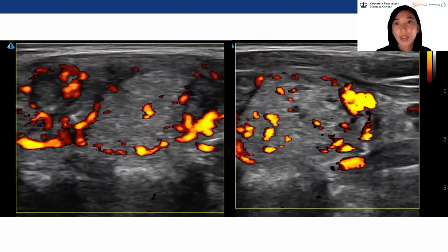And this is what her vascular supply looked like at 3 months. So you can see superiorly, the flow from that teeny tiny superior pole vessel came through and was feeding what I had previously ablated in the superior medial aspect of the nodule. And then inferiorly, although I couldn't capture it well, this vessel here was actually a very dominant feeding vessel to this inferior portion.